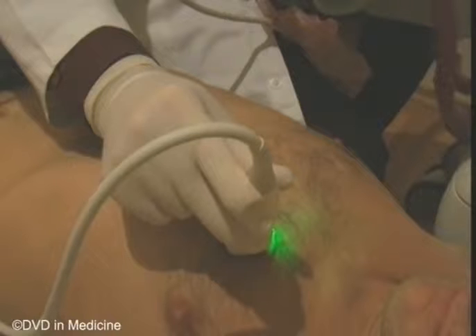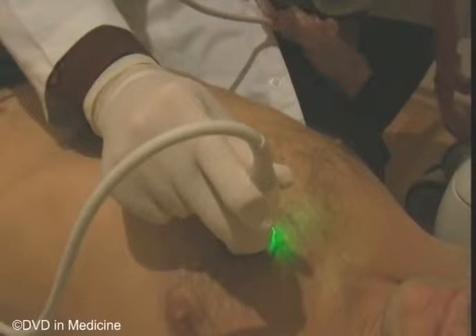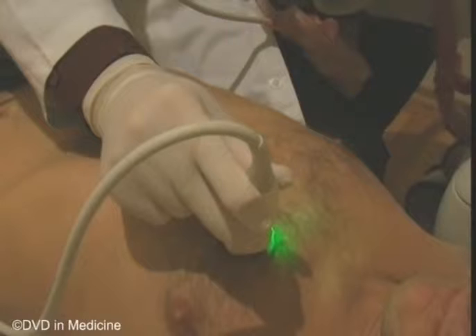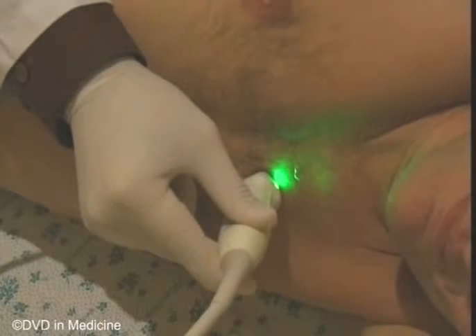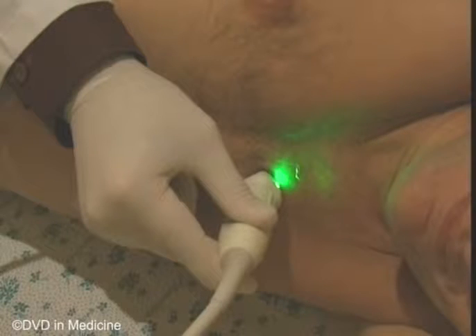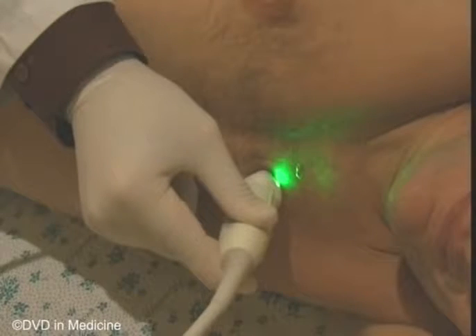One starts an ultrasound examination of the heart by obtaining an image using the parasternal approach. The scanning plane is located along the longitudinal axis of the heart. One places the transducer perpendicular to the anterior thoracic wall in the left third or fourth intercostal space adjacent to the sternum. The scanning plane should follow an imaginary line that connects the apex and the middle part of the right clavicle. One can perform the examination in the supine position, but it is better to turn the patient on his or her left side.